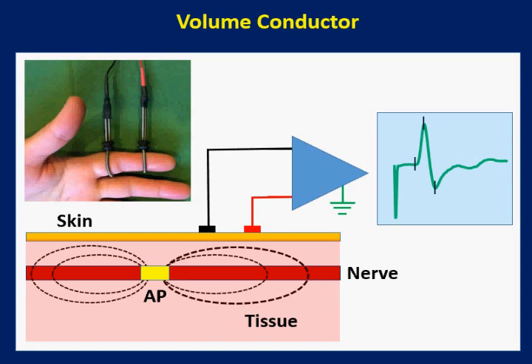generator site. For proper interpretation of the signals in EMG and nerve conduction studies, it is important to understand the relationship between the extracellularly recorded action potential to the propagating intracellular action potential.